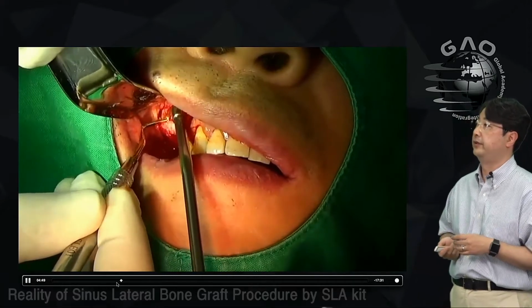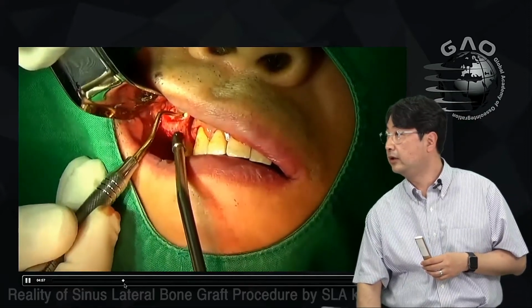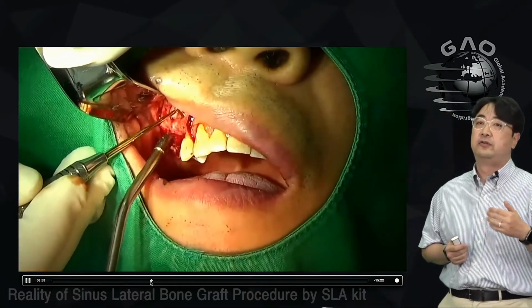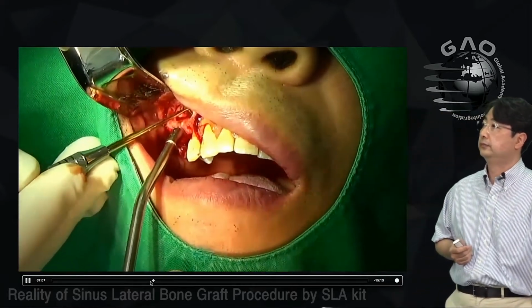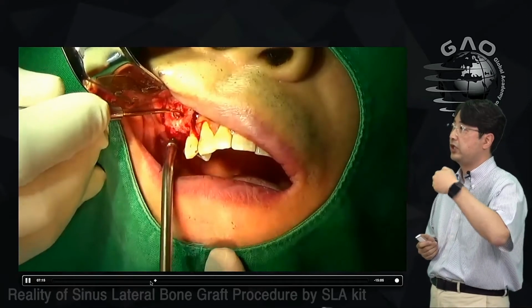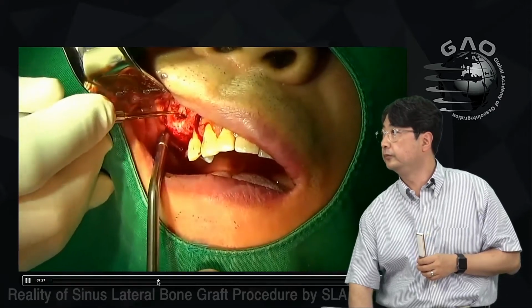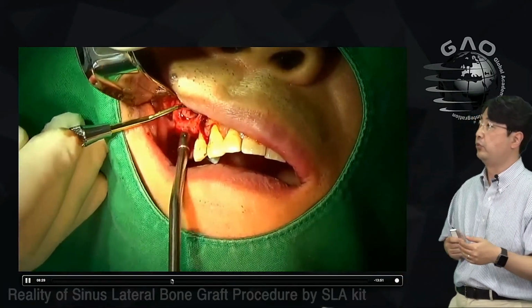So here I have number 1, a little bit above, then medial and distal, right? Now I'm using number 2 to go down, right? With number 2, you can go from the window to the crestal part. I'm not pulling down; I push out, and the tip of the instrument has to touch the bone, right? Then I'm using the wider part of number 2. Like this. And now I have number 3, right? To go further and to go down more.